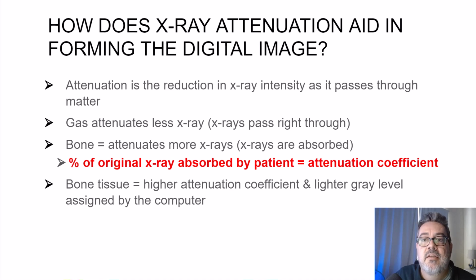But the point is, the data received by the image receptor, which comes from the remnant beam, has a limited ability to be manipulated by the software in the finished image. So you'll have better diagnostic images if you can provide a good signal to the detector as opposed to a limited amount of signal with a lower kVp in that particular situation for the football player.